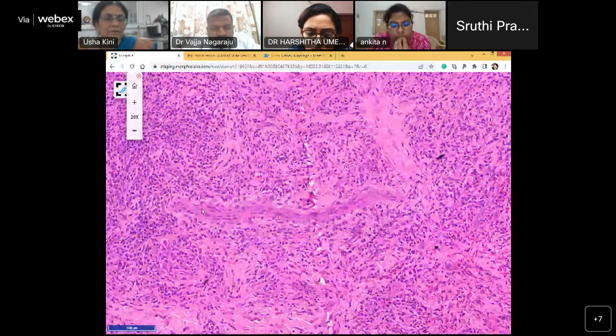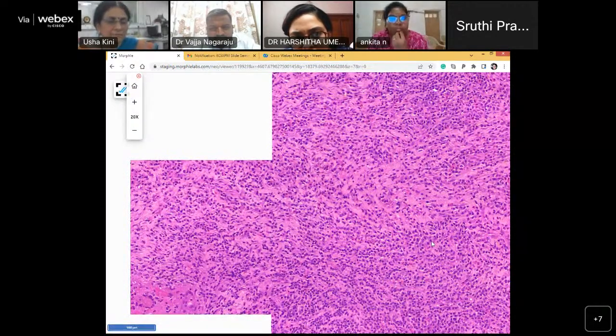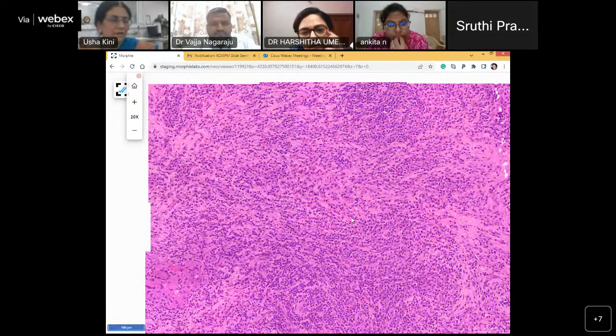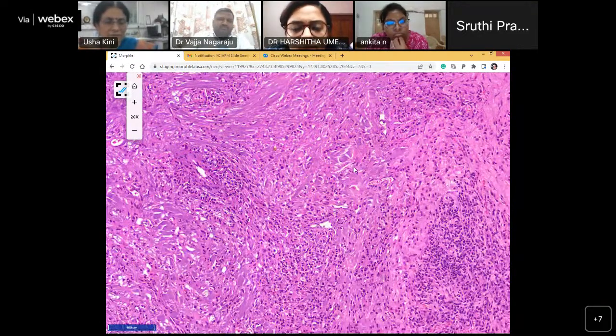Okay. Now I'm searching for blood vessels. I shouldn't be struggling so much for blood vessels. Okay, here is one blood vessel. There is one here, but you know what? What has happened to this tissue here? It's all blue in color, lost structure, identity.